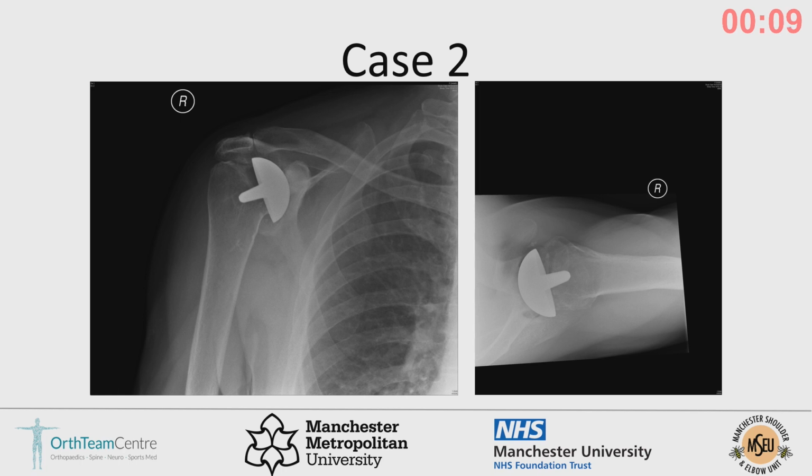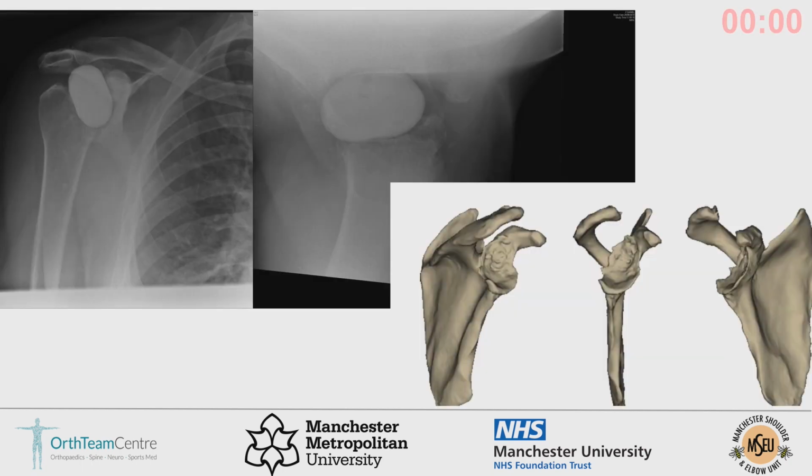This is a common failure mode for us with Steve Copeland's sort of massive resurfacing hemiarthroplasties. And in our experience, when you see this severe glenoid erosion, it's almost always associated with a P. acnes infection. And of course it was in this case.